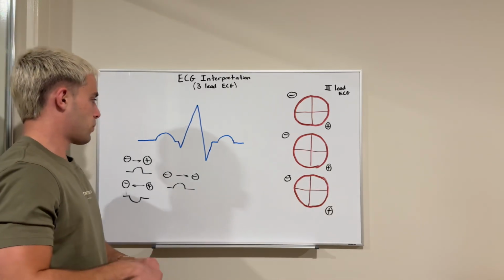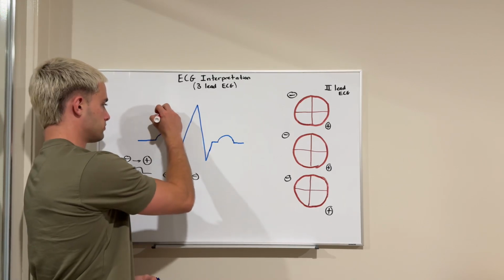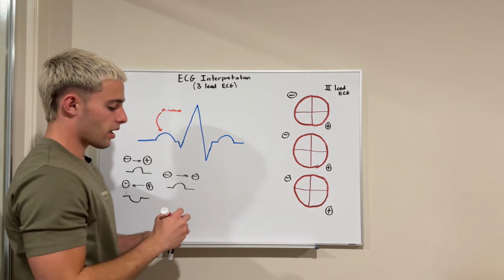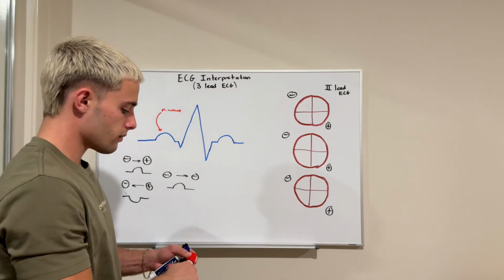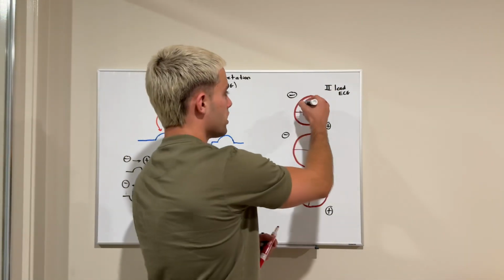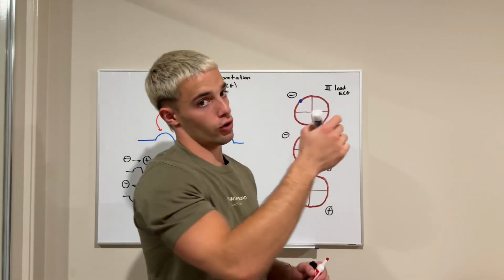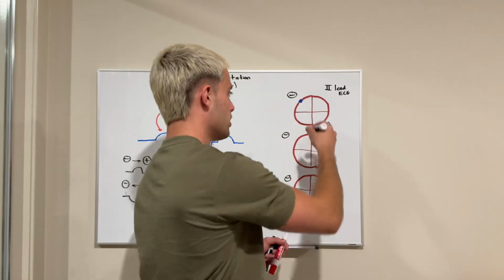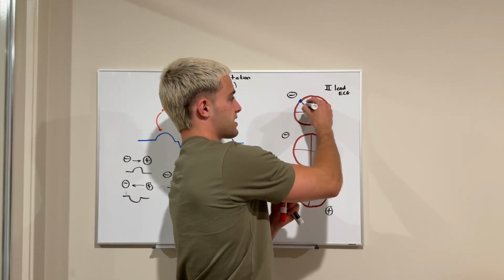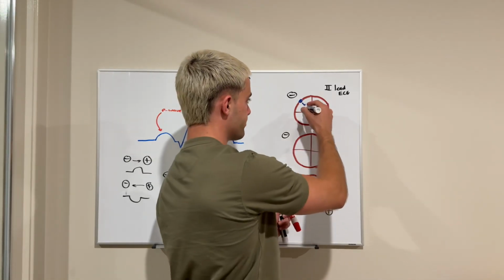With the ECG waves, first of all, we have the P wave. And the P wave is showing us that in this cross section of the heart, if you have the SA node over here, which is the sinoatrial node, or the pacemaker of the heart, during the P wave, the action potentials are moving from the SA node to the atrioventricular or AV node.